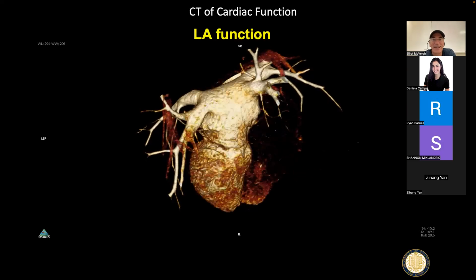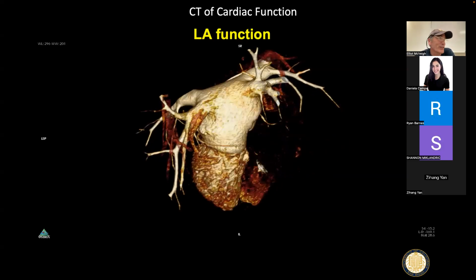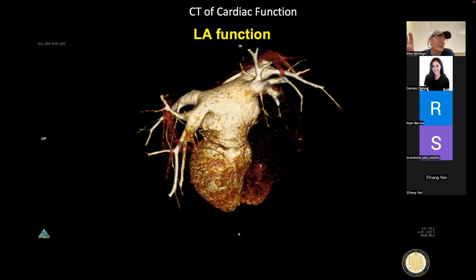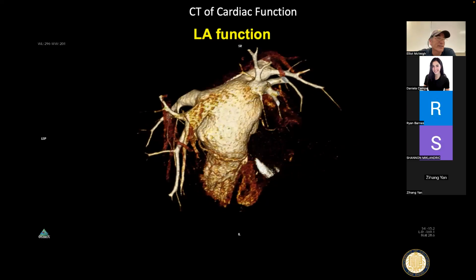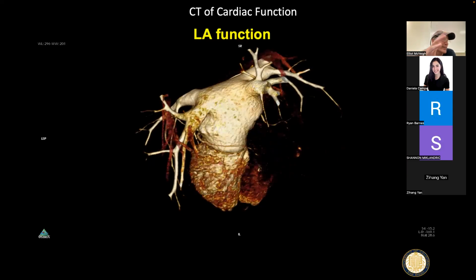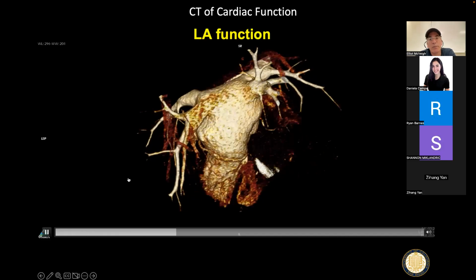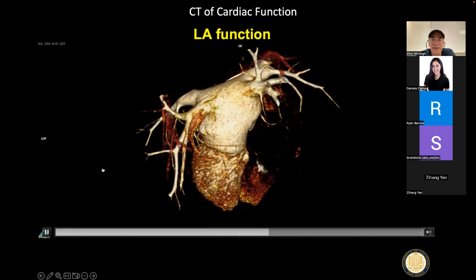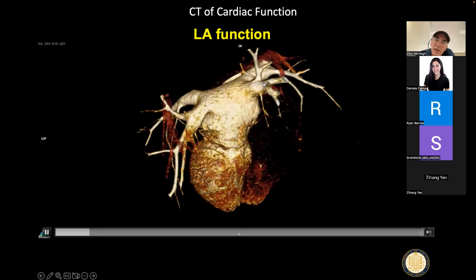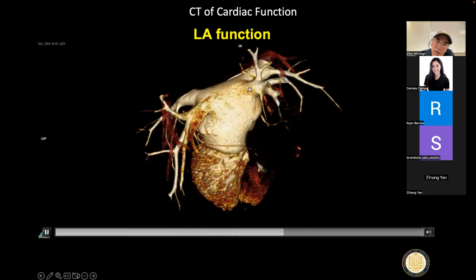Absolutely. Right. So the next question is, well, one pulse of contrast is one function you could use. It's a simple function. It's like a square wave, top hat. What if I use some really complex function that encoded various flows? And so you could use a set of pulses that came closer together, like a chirp, or whatever, right? So it's a pretty cool idea. It turns out modeling this stuff is really hard mathematically, and so whether or not you get a stable solution is questionable.